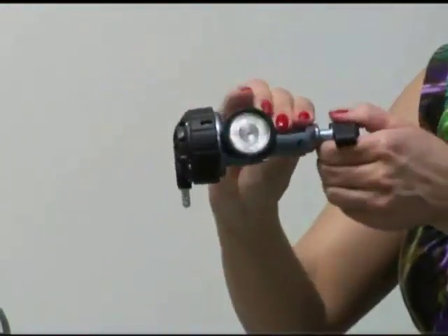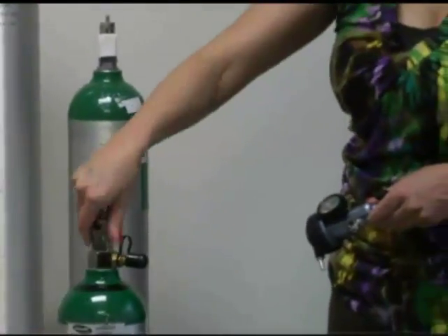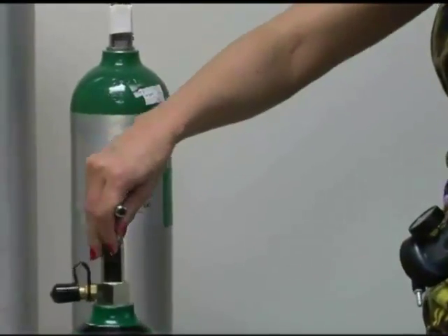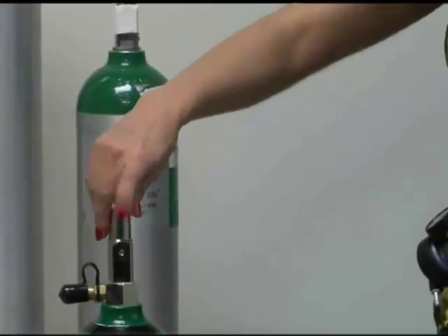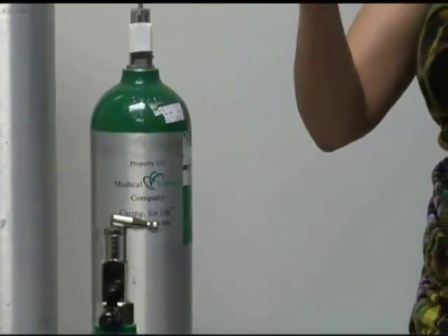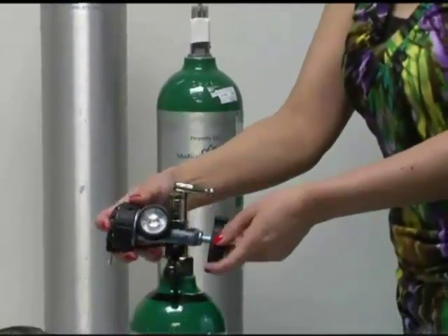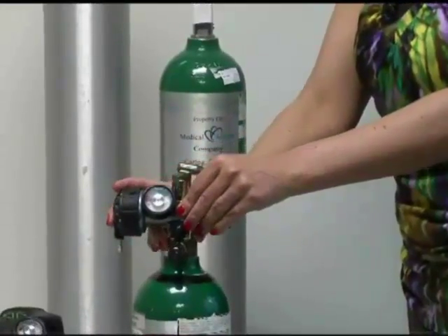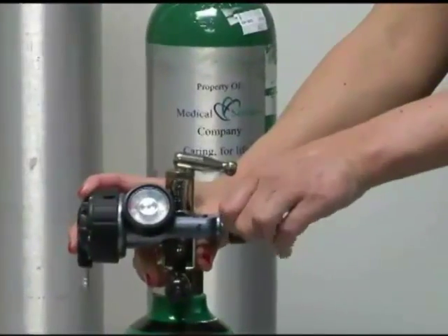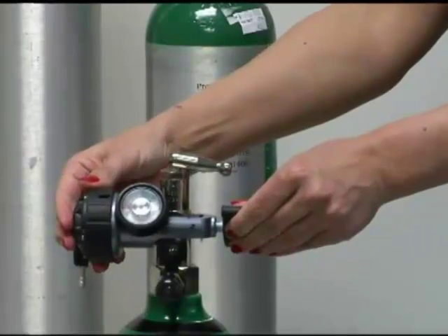Once you've got your gauge and it's all ready to use, you're going to take your tank. On your tank you should have three holes on one side and one hole on another side. You just want to line this up so that you can take your gauge, slide it right over the top, line up your three holes with your three prongs, and then just twist the handle and keep turning it until it's tight.